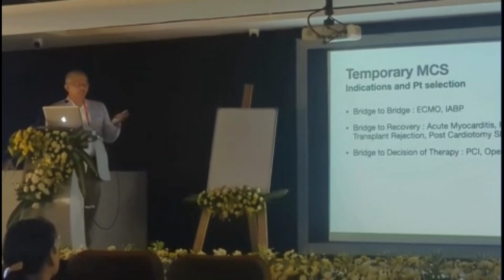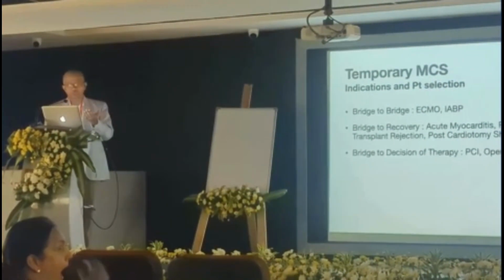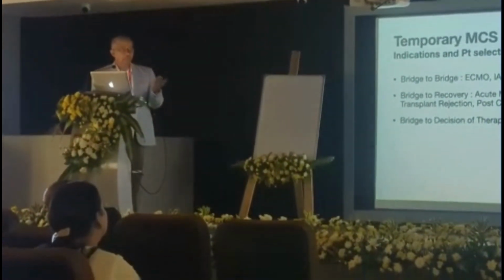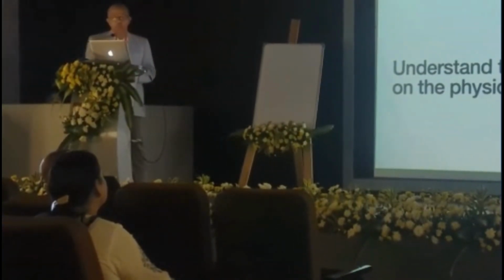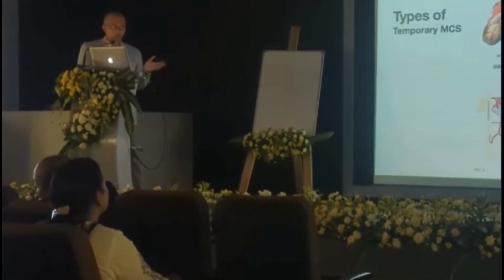Then the bridge to decision of therapy. Once you know that this patient is not coming out, you have to decide whether we have to do a transplantation or whether he needs an LVAD, depending on all his other parameters, which we will study later on.